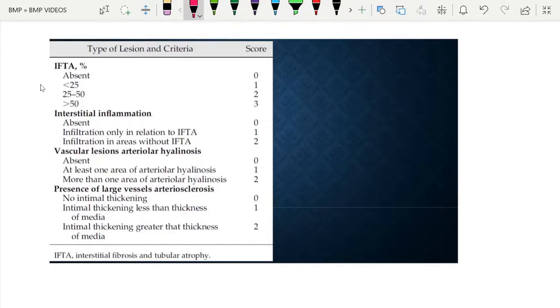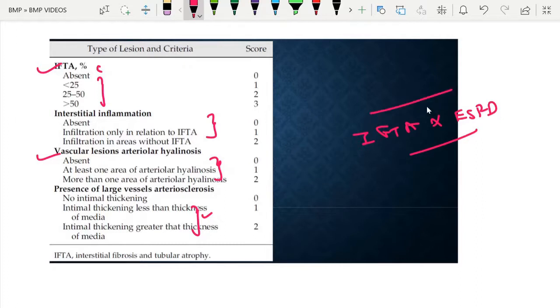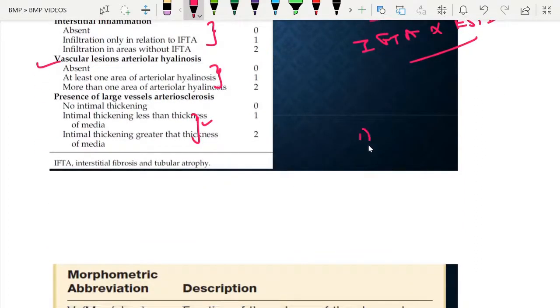For interstitial and vascular scoring, scores of 0 to 3 are given based on the degree of interstitial fibrosis and tubular atrophy, interstitial inflammation, vascular lesions, and hyalinosis. Higher scores correlate more with renal functional loss and greater chance of progression to ESRD. A drawback of this classification is that it doesn't include some important findings like capsular drop and certain endocapillary findings.